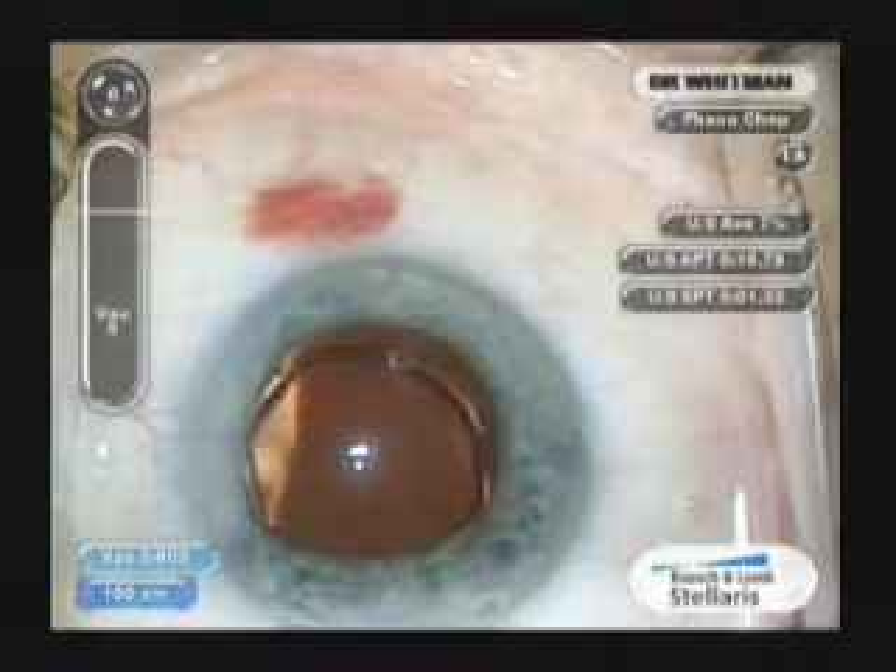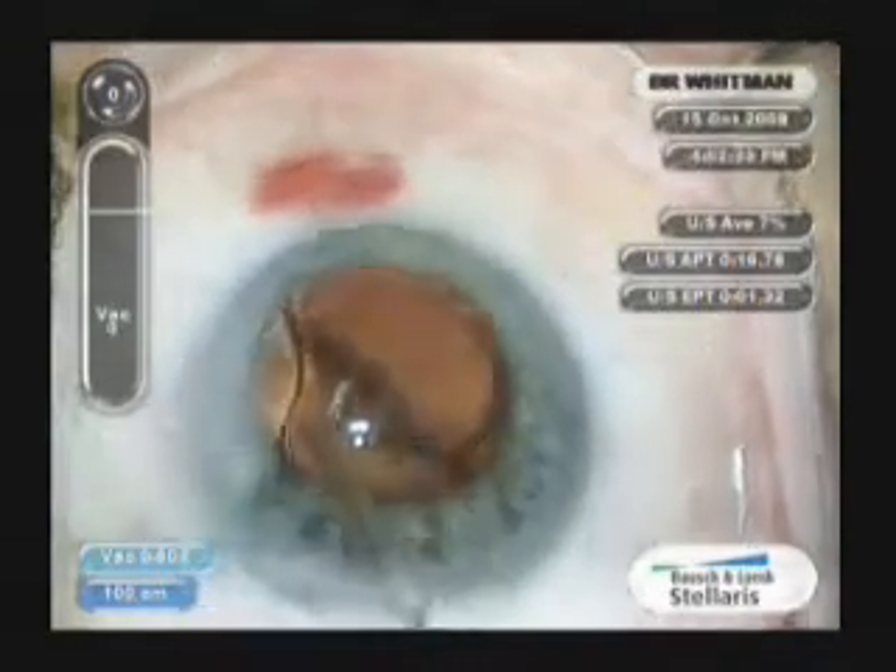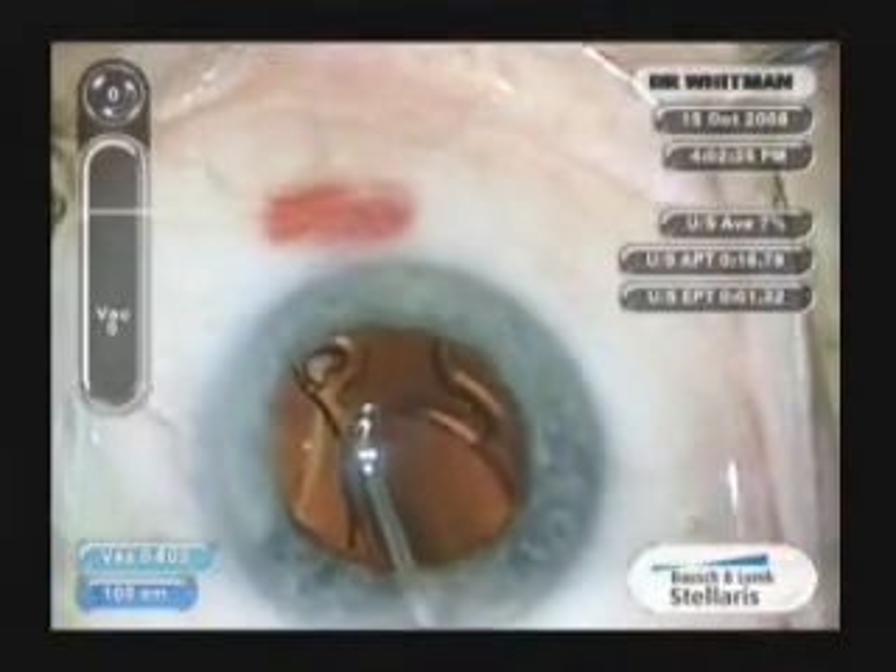Again, you can see the bump on the left — it should be on the right for the leading haptic. You can see that it is incorrect on the right.